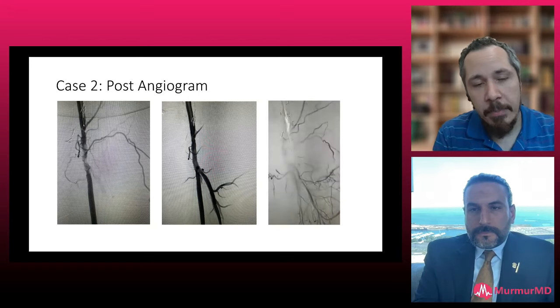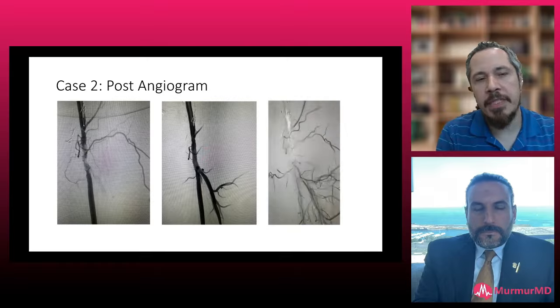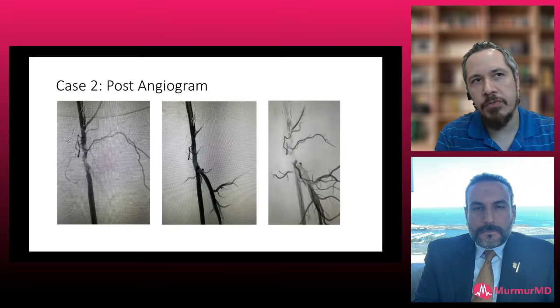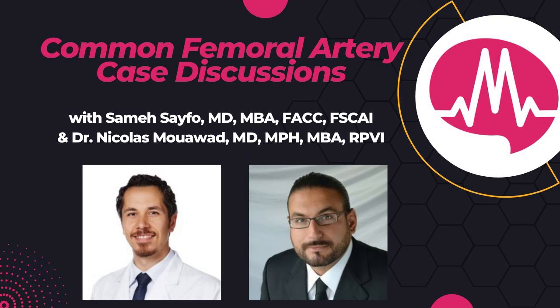Yeah, stenting is on the back end for us. I really try to avoid doing stenting in the common femoral. Common femoral for me is what we use for our cardiology work most of the time, with Impellas and TAVR and all the other stuff.